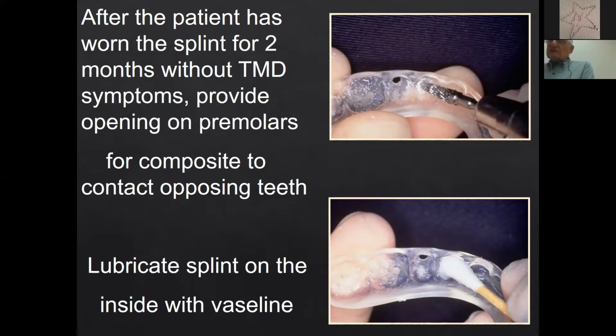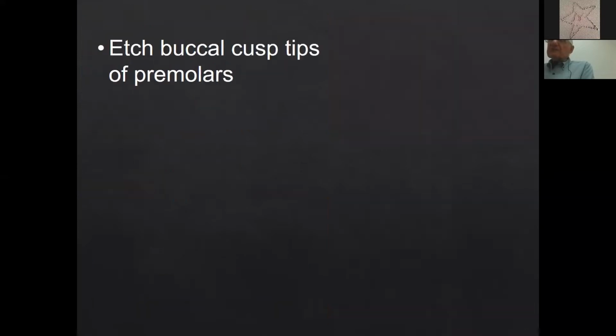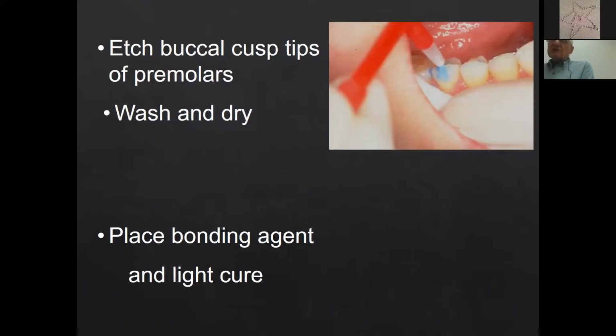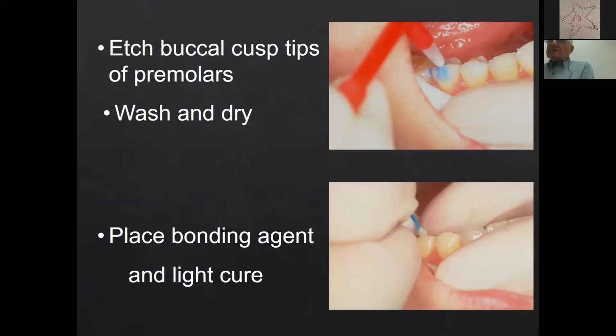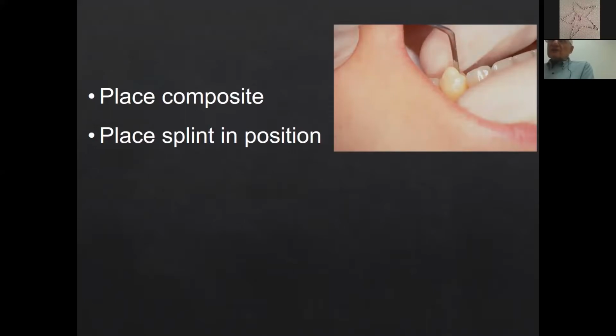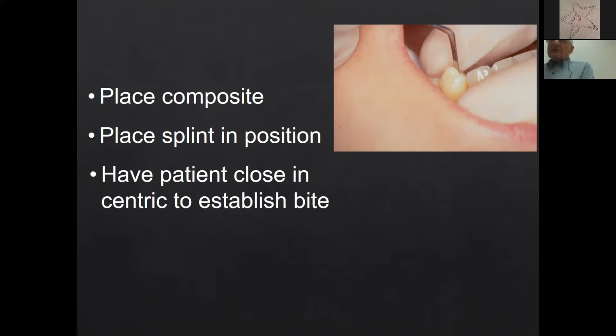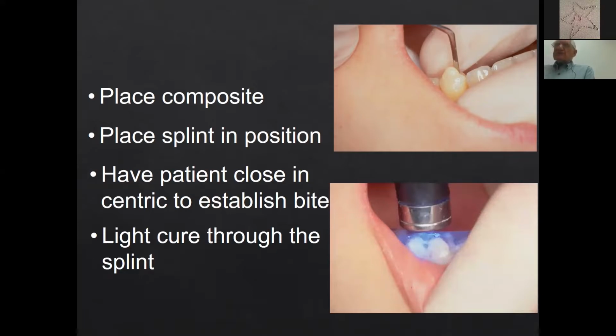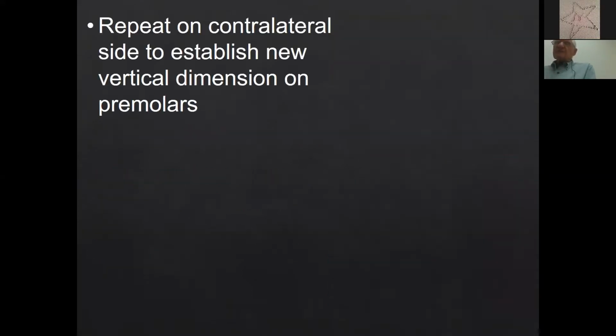Lubricate the splint on the inside with petrolatum. Etch the buccal cusp tips of the premolars. Wash, dry. Place bonding agent and light cure. Then we place composite on that buccal cusp tip and put the splint back into position. Have the patient close and center it to establish the bite and light cure through the splint. We repeated that on the contralateral side to establish a new vertical dimension just on the premolars.